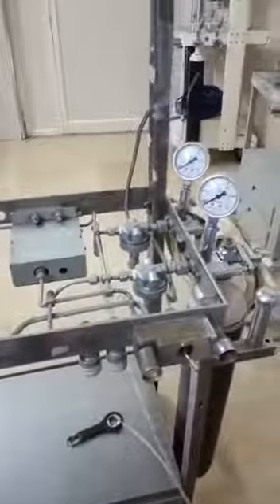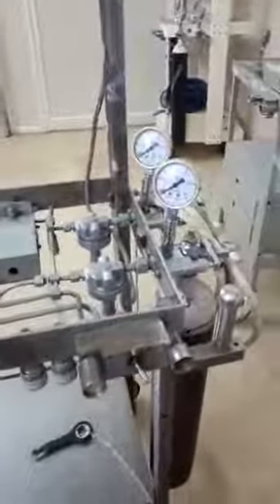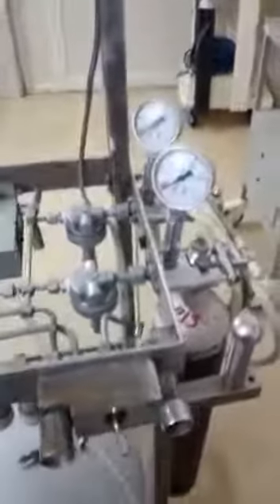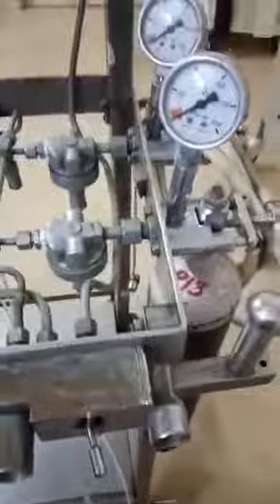Boyle's machine was invented by Henry Edmund Gaskin Boyle in 1917. His machine was a modification of the American Guthrie apparatus of 1912 and became the best-known early continuous flow anesthetic machine. The anesthetic machine dispenses the gases that are necessary to induce sleep and prevent pain.